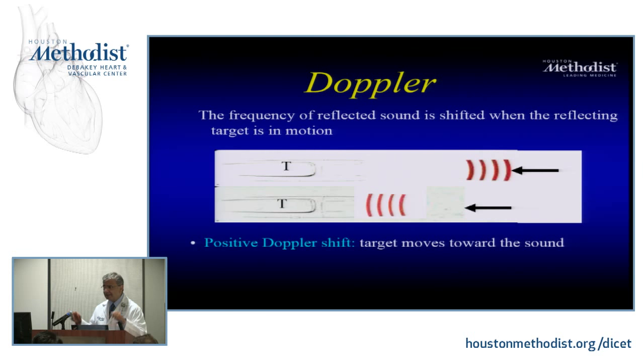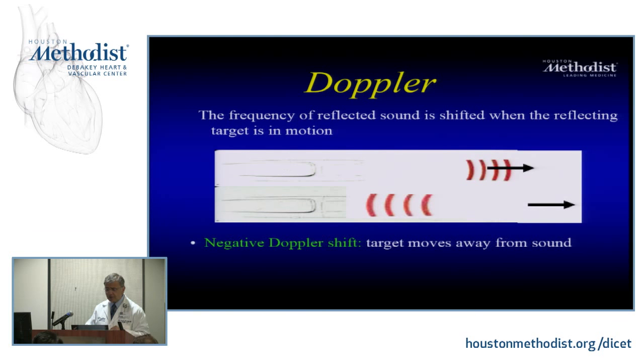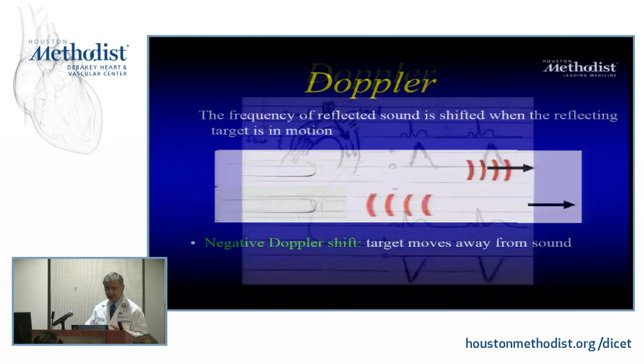And in the past, we used to have stereo things, so the positive wave is on the right and the negative wave is on the left. We went through some interesting learning curves. So that's what the Doppler thing is.